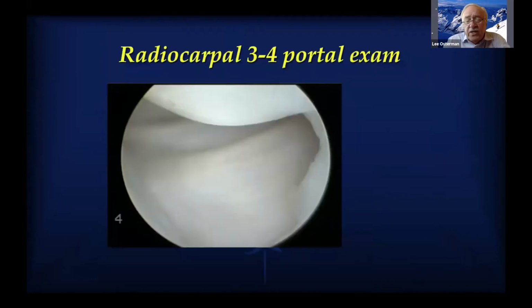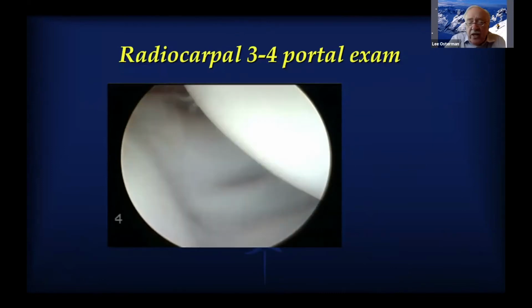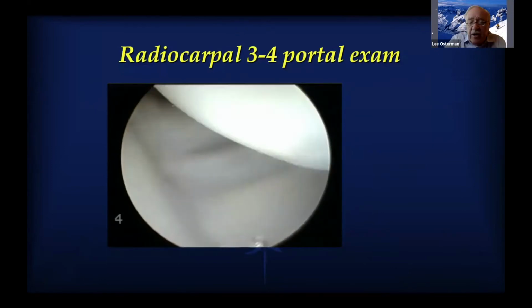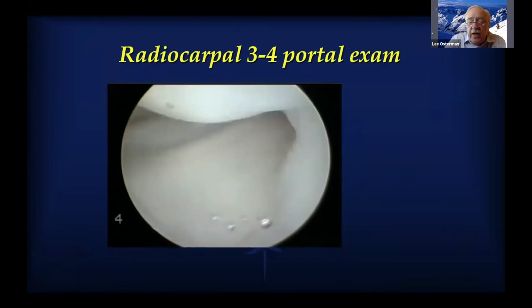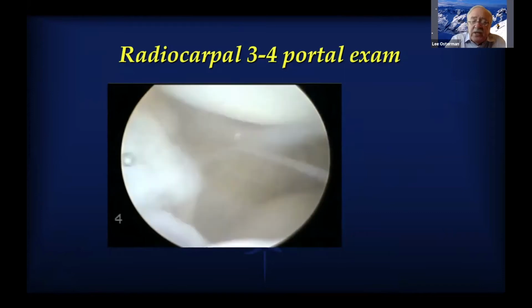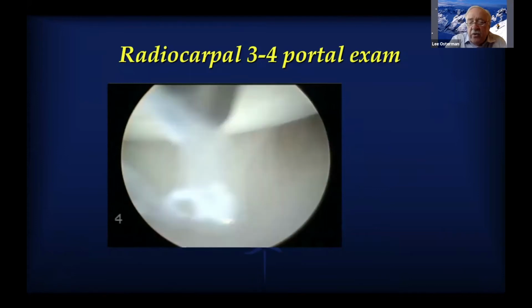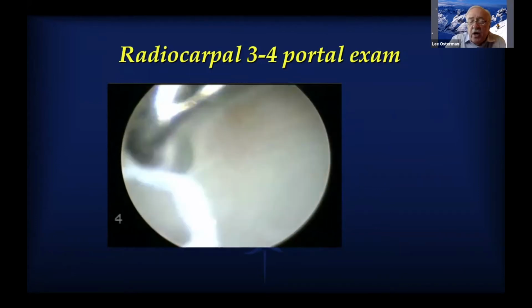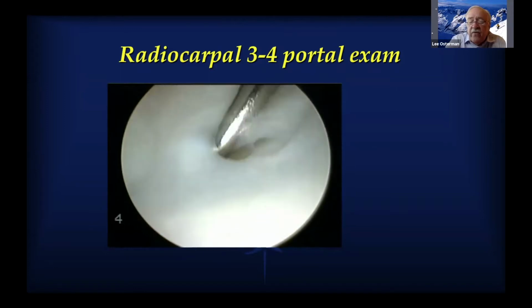Improved wrist anatomy: looking at this classic 3-4 portal, we see the radial extrinsic ligaments, the radioscaphocapitate, the long radiolunate ligament. We see the vascular leash. We see the lunate above, the radial facet below. We're looking now at the short radiolunate ligament. As we swing over, the probe is in from an ulnar portal. We see a small linear tear in this triangular fibrocartilage.